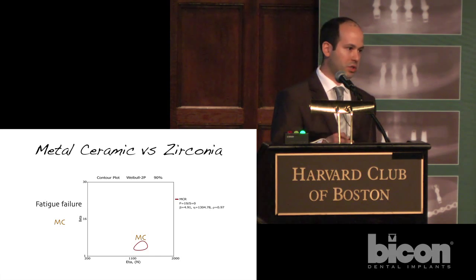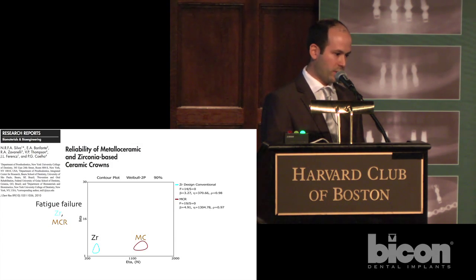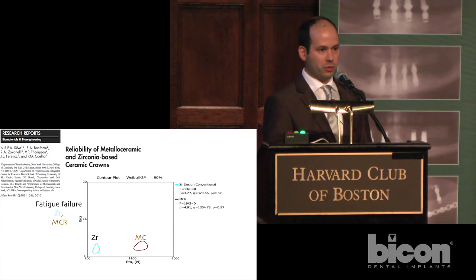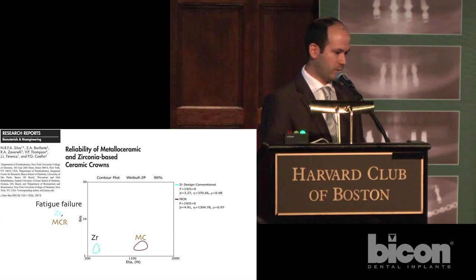And let us see where zirconia is in this scenario. It is performing significantly lower in terms of fatigue strength. And this was also published a few years ago. When you see these contours, when they do not overlap, it means that they're significantly different.